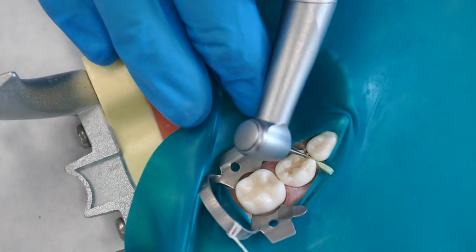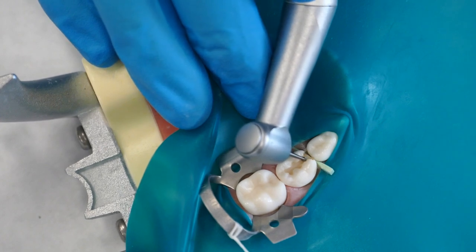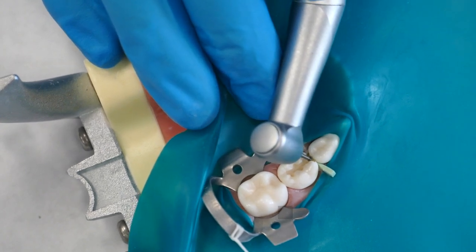Remove any remaining caries with a sharp spoon excavator or with a round burr in the low-speed handpiece.